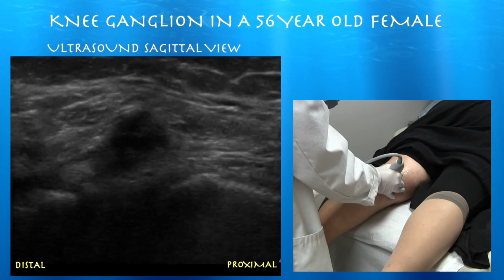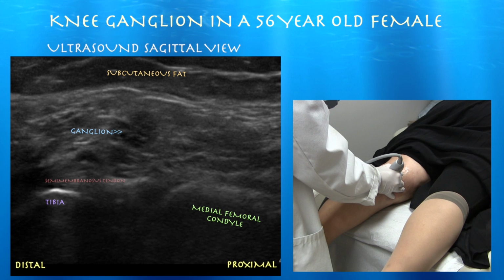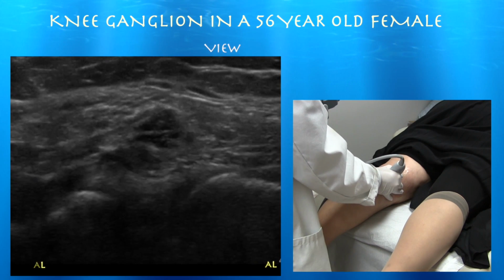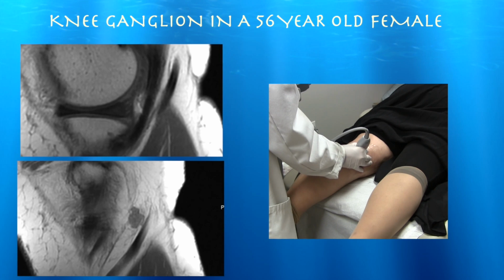Here is that ganglion, I believe. Here's the ganglion cyst, somewhat inconspicuous as it kind of blends in with the surrounding subcutaneous fat. A little bit tender in there, huh? Mm.